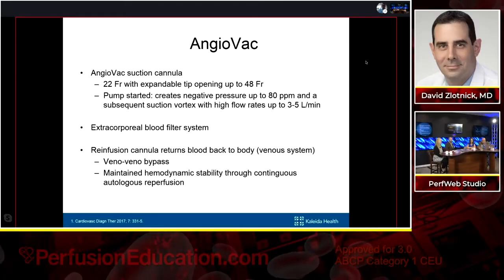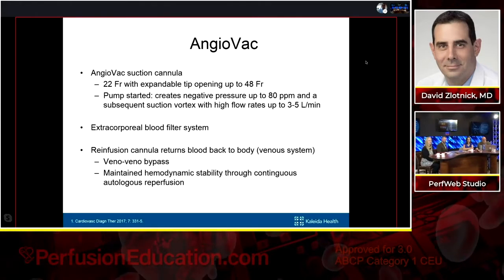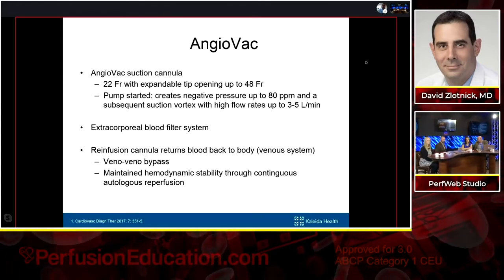We're basically going to talk about the AngioVac, and I know Mark's probably going to go through most of this with you guys, and this is just sort of a recap for me.